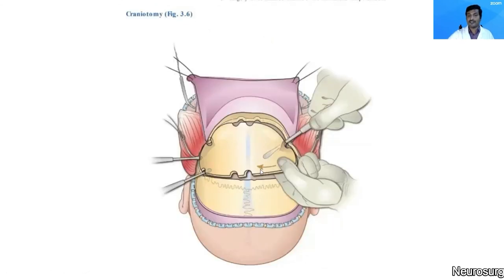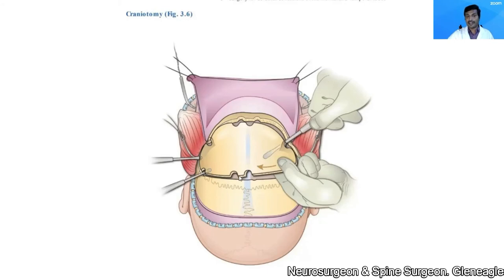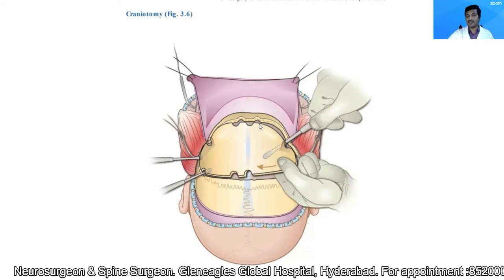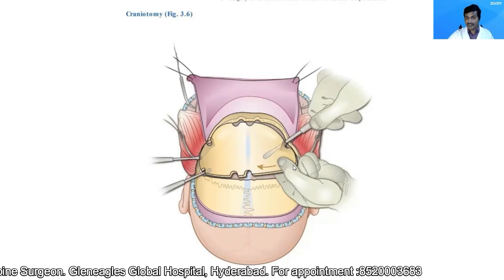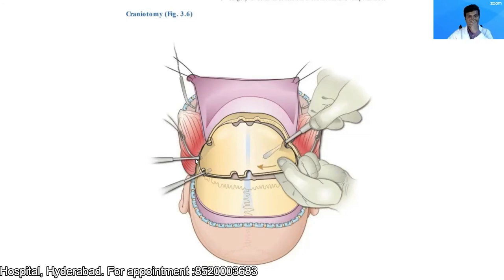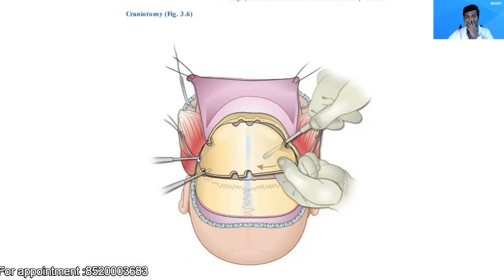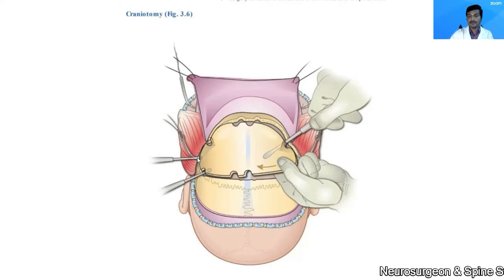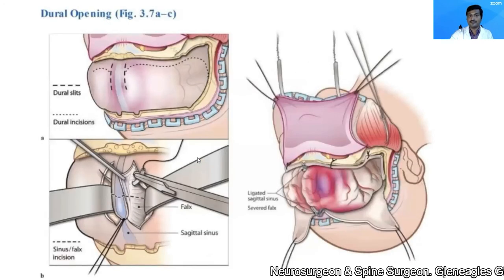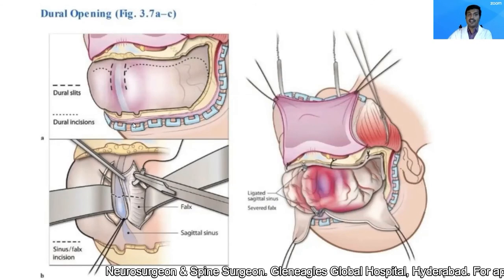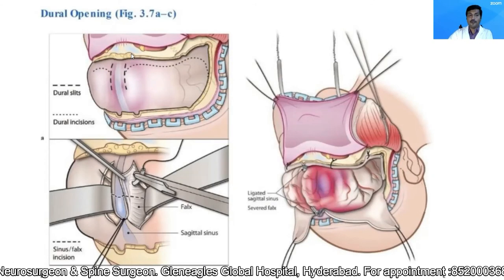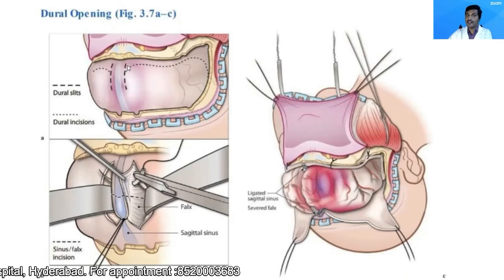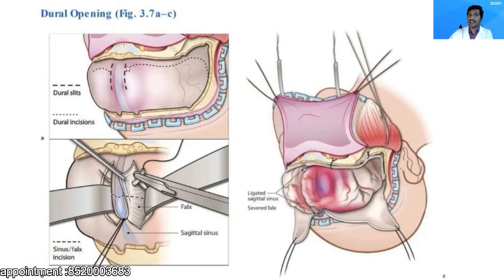Once you have connected all the burr holes with the craniotome, followed by connecting the two paramedian burr holes, reflect the bone flap back. At this point, if you have opened the frontal sinus, I prefer to place a small flap of galea over it — that is, I will exenterate the sinus at this point.